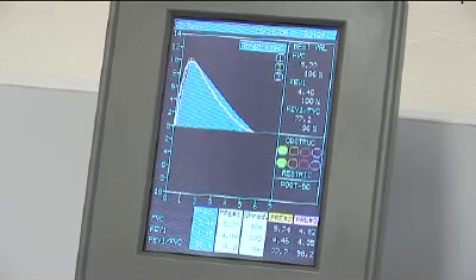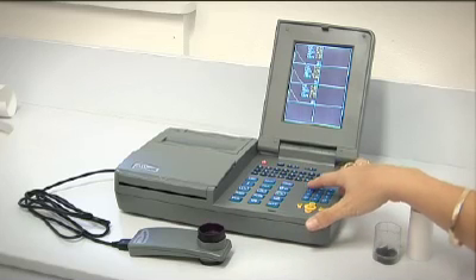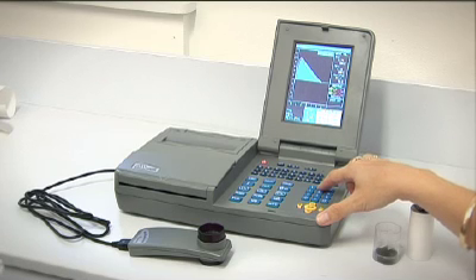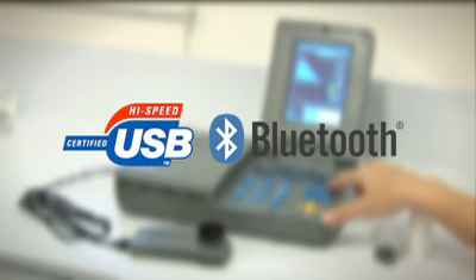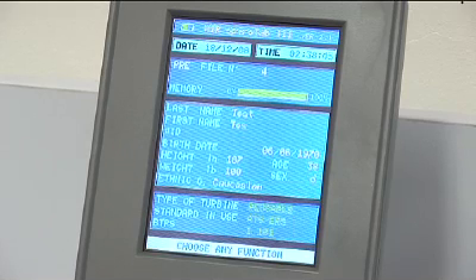Your MIR SpiroLab 3 has a high-resolution colour screen and internal battery that makes it suitable to operate independently as a mobile device with a 6000 test memory and an internal printer. It can also operate in a paperless office environment with USB and Bluetooth networking capability. The SpiroLab 3 comes with medical director compatible management software.